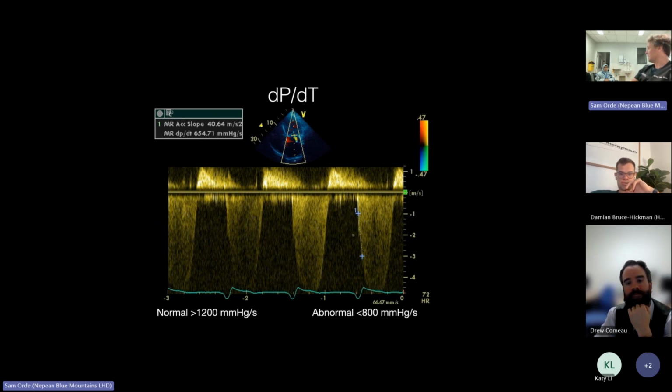But how confident are you in this measurement? Have you ever done this measurement before? It's pretty easy to make this number 2000 or 2 or 20 just by moving this cursor a very, very small amount. So I think probably what I'd say is that it's probably not that accurate when you do it like this.